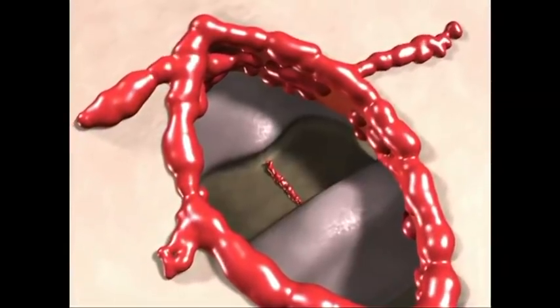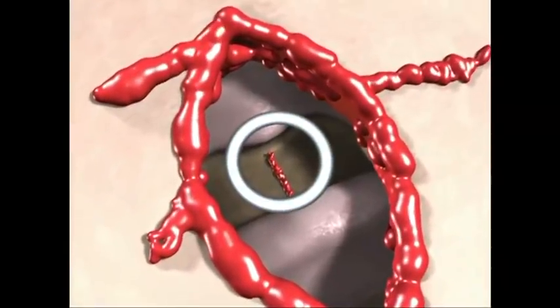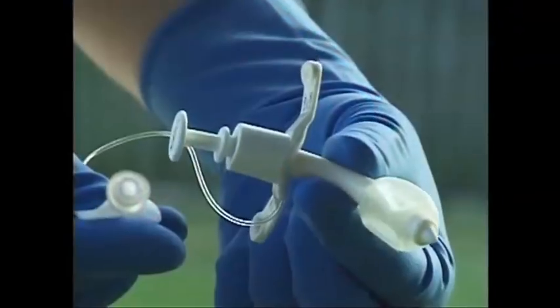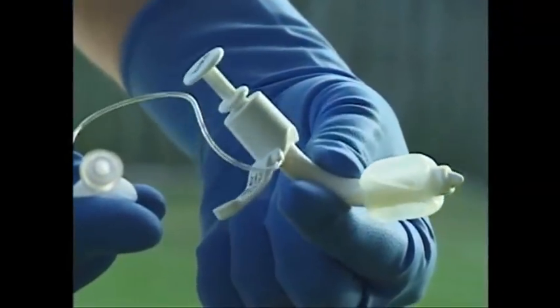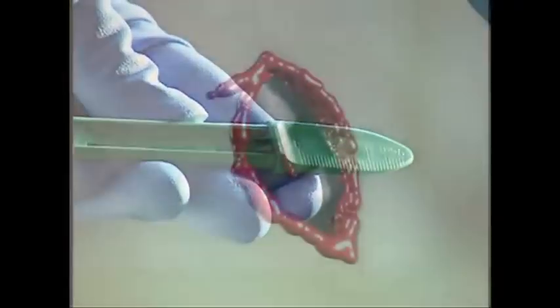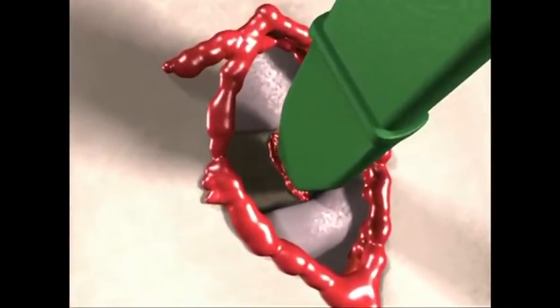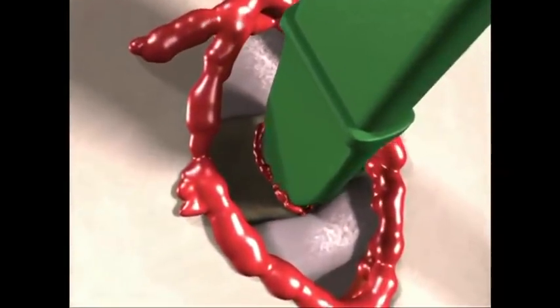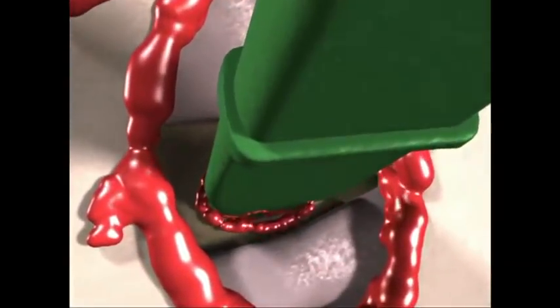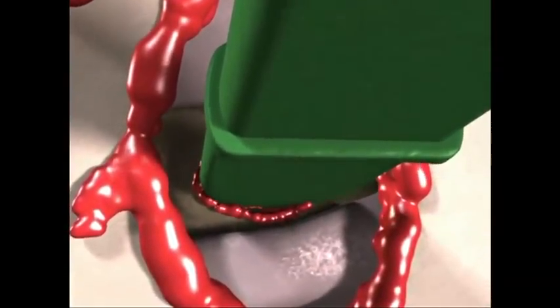At this point, it is necessary to enlarge the opening in the cricothyroid membrane to allow insertion of the tracheostomy tube. This can be done by using a hemostat or by inserting the handle of the scalpel into the opening and twisting it to open the space between the cricoid and thyroid cartilages.